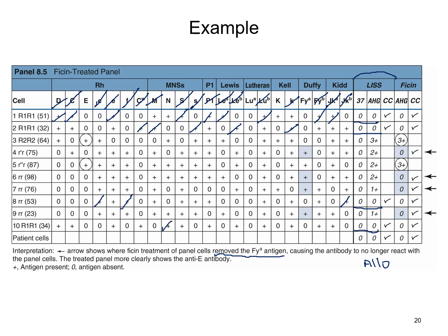Here we got N, and E is not in there. All right, just looking through these last ones that we got left. So based off of that rule out, we're still left with E. Lutheran A, it's not likely. Kell can't rule out. So that's what we're left with, as well as the Duffy.